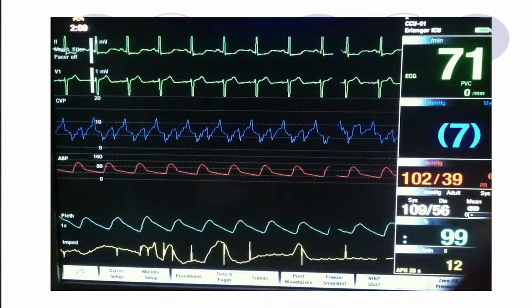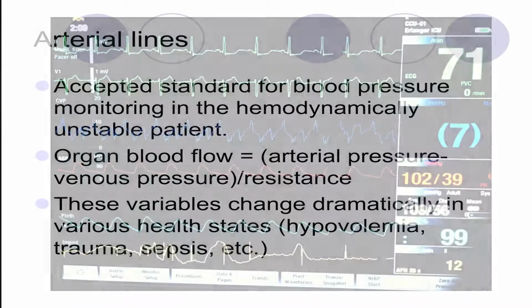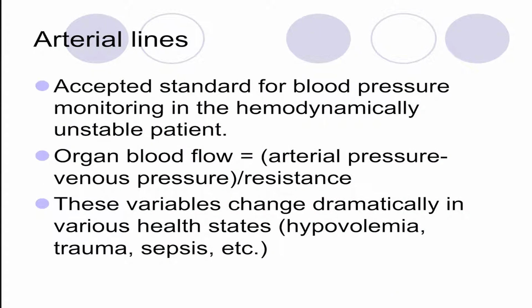Right. And by echo, this patient had CHF and diastolic dysfunction following this. So you can see a nice tracing on the CVP with this, but this is an example of following those A waves, that you can see that that's much more peaked than it should be. You should have a smoother line.